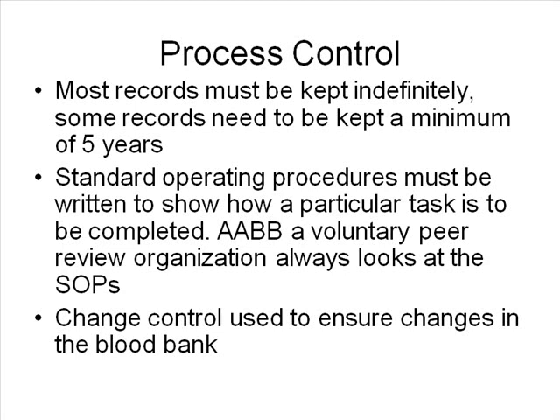I say, okay, let's see what the temperature is. Now, if that gal took it and went like this as she's walking down the hall because she's warming it up for her patient, when she gets it back to the lab, if it is more than 10 degrees, wasted, throw it away. Okay? But if she kept it in the little bag or however she transported it, it might be okay. All right?